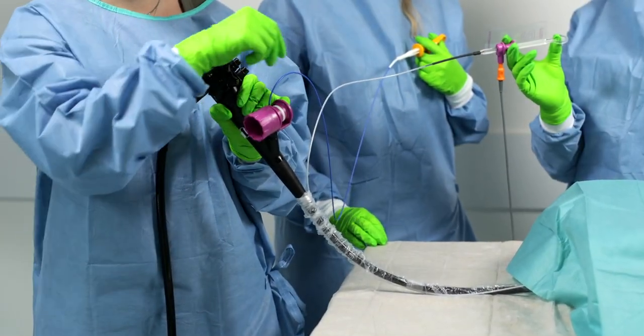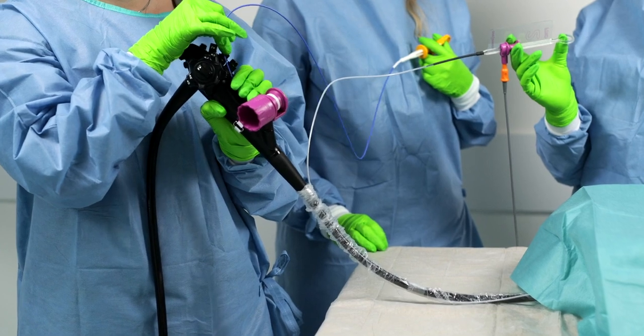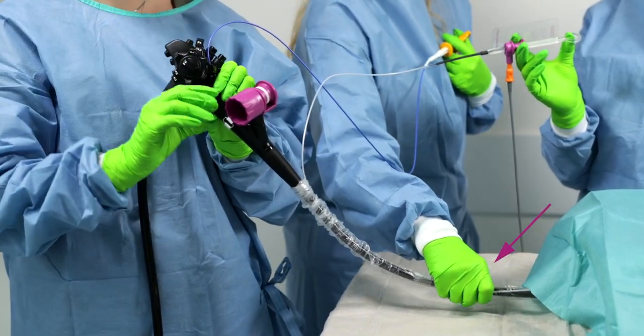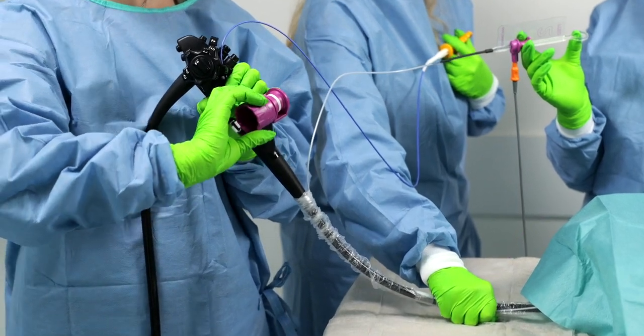Before clip application, it should be ensured that the endoscope is fixed, for example by holding it firmly so that the endoscope does not slip off the target tissue during clip application.